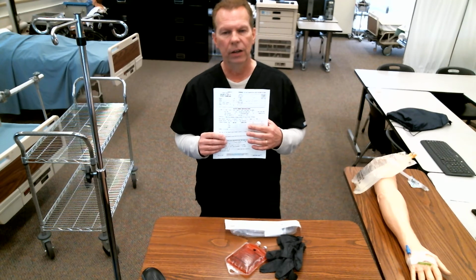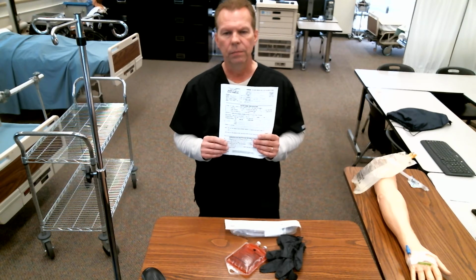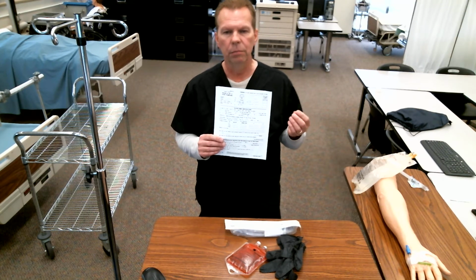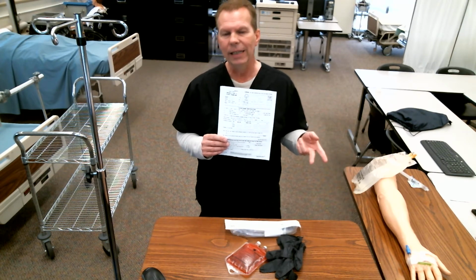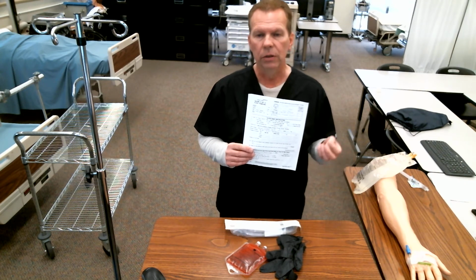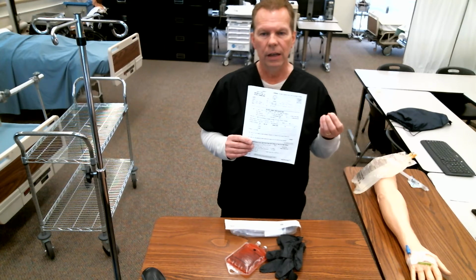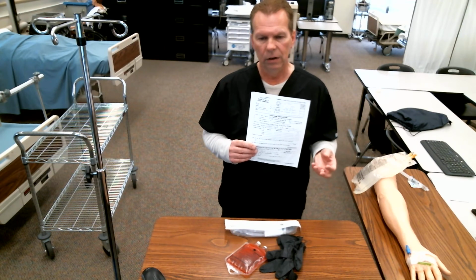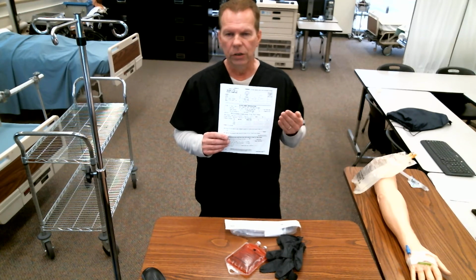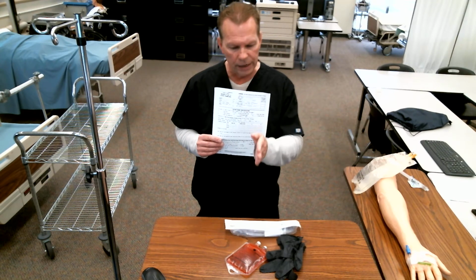We want to make sure of any other tests that we might have to have done before we administer the blood. We want to check the blood bank unit number and the blood ID number. So there's a couple of numbers there, and those are a really big deal. So the blood type of recipient and donor, RH factor of recipient and donor, and the identification numbers of the blood are really big deals that you want to check. Make sure that you do these 3 checks and check these numbers 3 times. Check them carefully. Look at number by number.